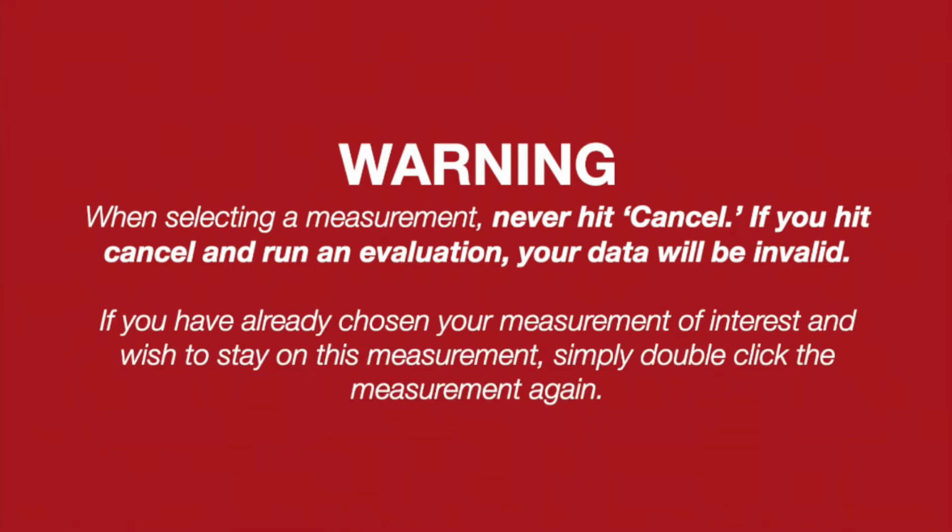If you have already chosen your measurement of interest and wish to stay on this measurement, simply double-click the measurement again.